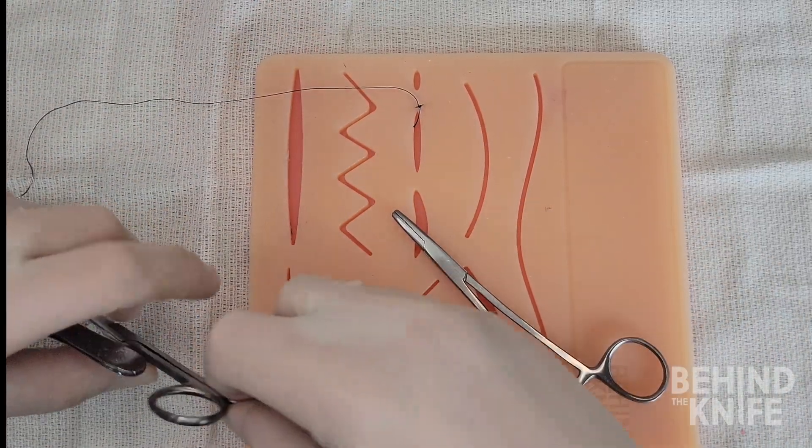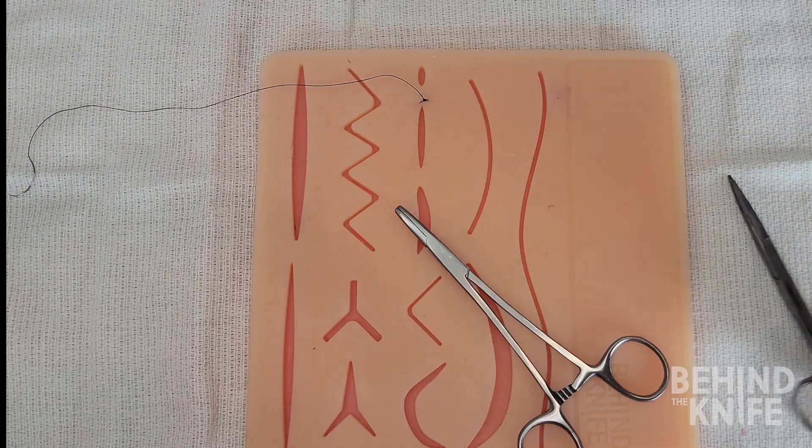After we tie down this anchoring stitch we can trim the short tail but we'll reload the needle without cutting the long tail.